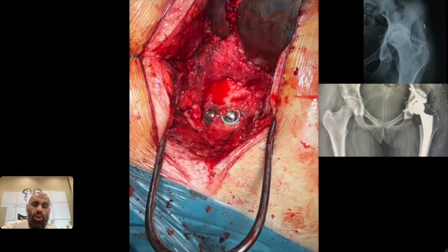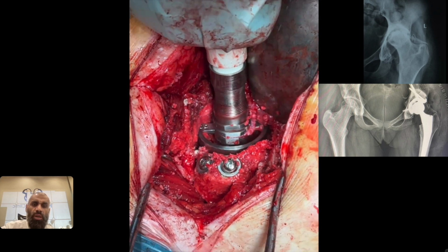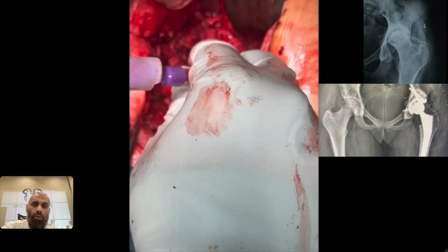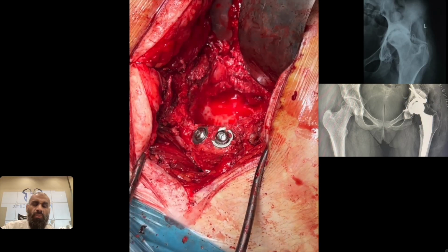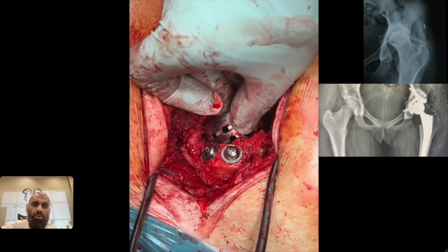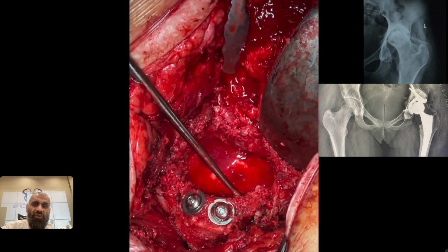But one should avoid vigorous hammering to avoid fracture of the graft, which is now a very precious piece of bone, because it's an autograft which will help more in osteointegration for such a young girl. One should be sure that the floor of the acetabulum is clear, so you avoid lateralization of the cup. So now the reamer is okay. Start to engage the graft.